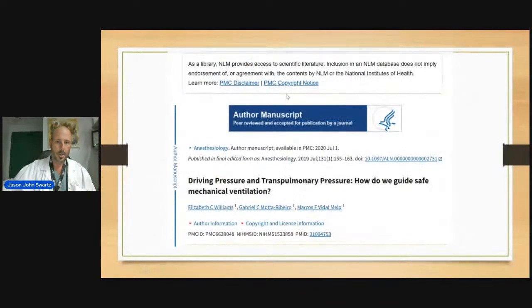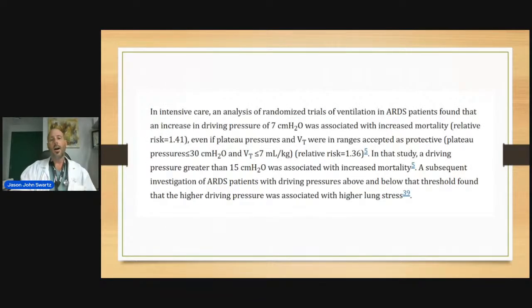Current slide. Yeah, so this is the study that I've been citing: driving pressures and transpulmonary pressure, how to guide safe mechanical ventilation. Here's another screenshot of the study. I don't like just reading stuff in a PowerPoint presentation, but I think reading a few of the citations is worth it because it's very, very important information.